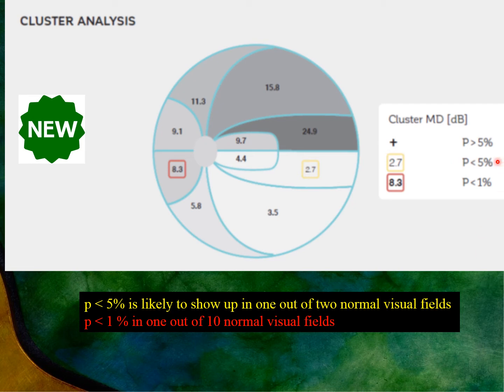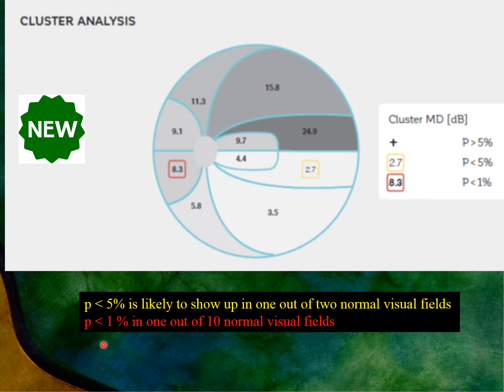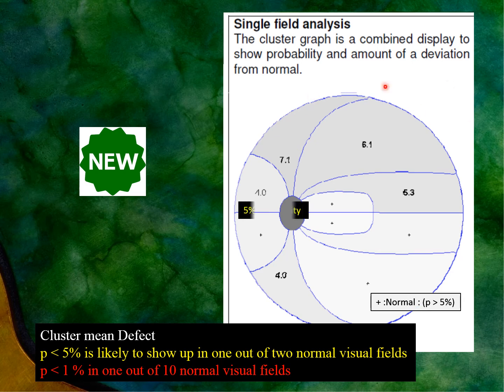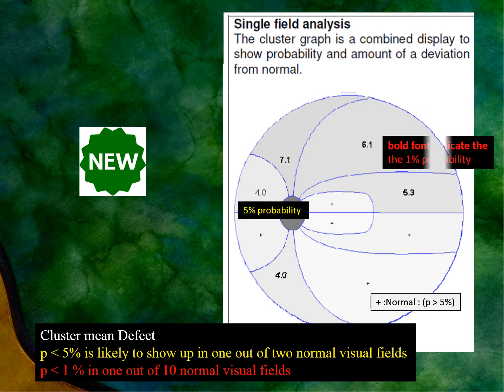Cluster results include probability levels. A probability of less than 5% means this value is likely to appear in only one out of twenty normal fields. A probability of less than 1% means the value is likely to appear in only one out of one hundred normal fields. The cluster analysis provides better information than individual point locations and is available in the new software.